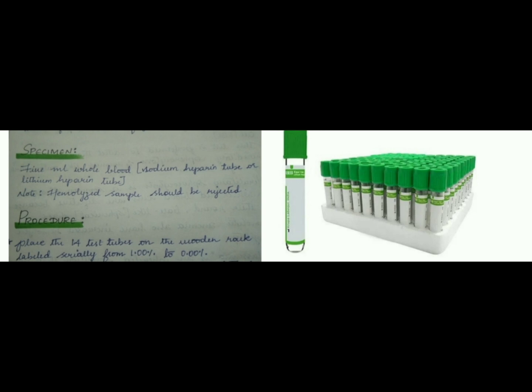It should be collected in a sodium heparin tube or lithium heparin tube. But note it, a hemolyzed sample should not be used. It must and should be rejected.